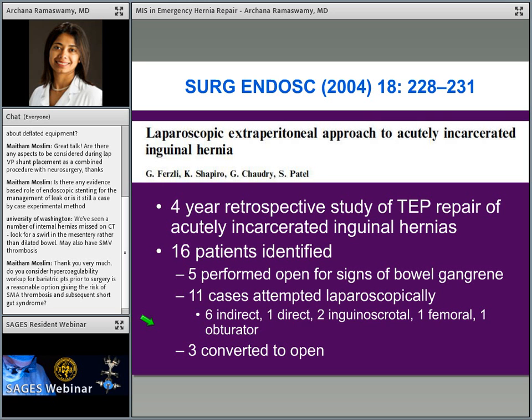And actually, that video that we couldn't get to work even showed how you can do your suture repair laparoscopically. You don't even have to open that patient. If the bowel looks okay, but you're still a little bit concerned about them, there's nothing wrong with stopping there. I do think that there is enough data, though, that you could support putting in lightweight mesh when you have minimal contamination in these hernia repairs. Right. Thank you.